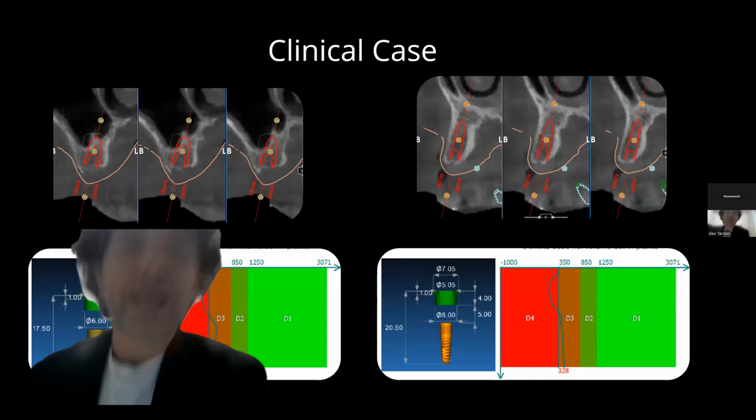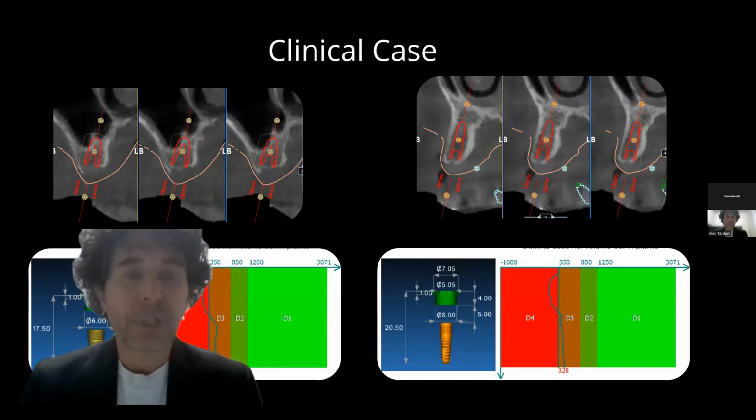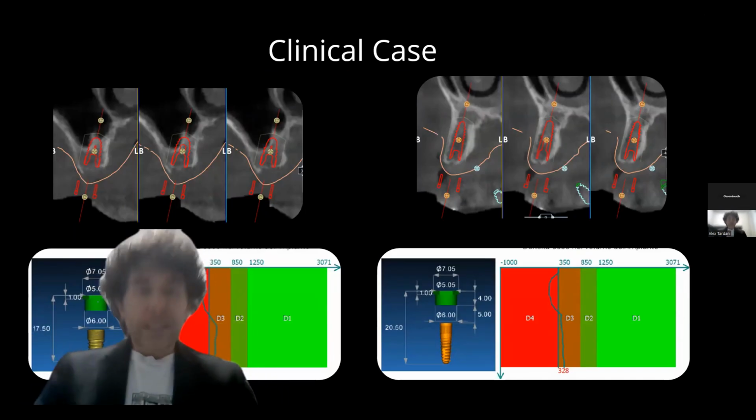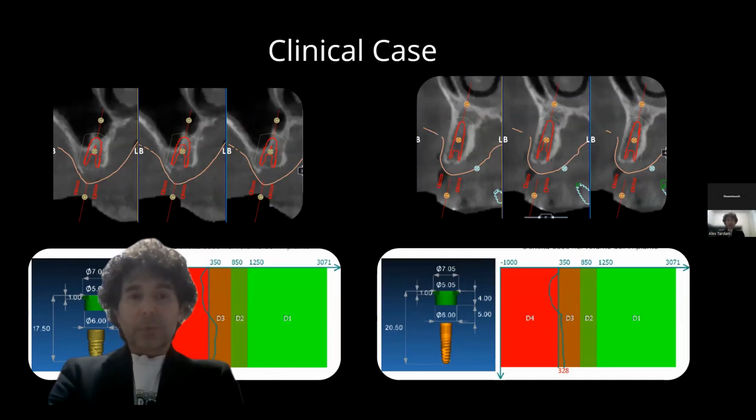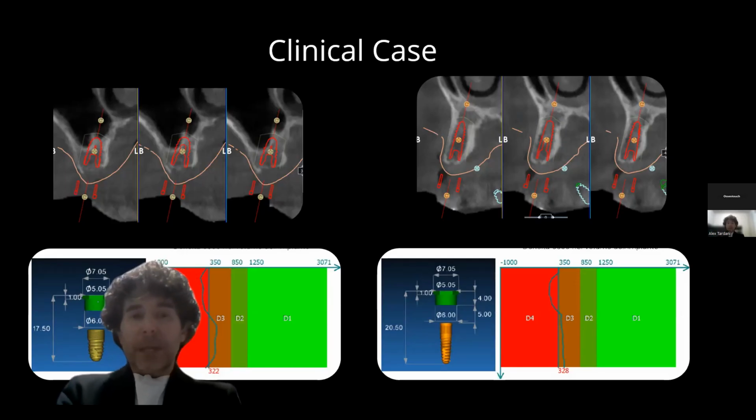to address are. So we can see that the implant at site 16 would require, if we want to place it in a correct position from a prosthetic standpoint, a minimal displacement of the cortical bone and the sinus to get a good buccal aspect, but using the mallet allowed me to place it in the prosthetically ideal position with very little effort, without having to use any drills and guaranteeing a safe placement without fear of damaging the sinus in that position.